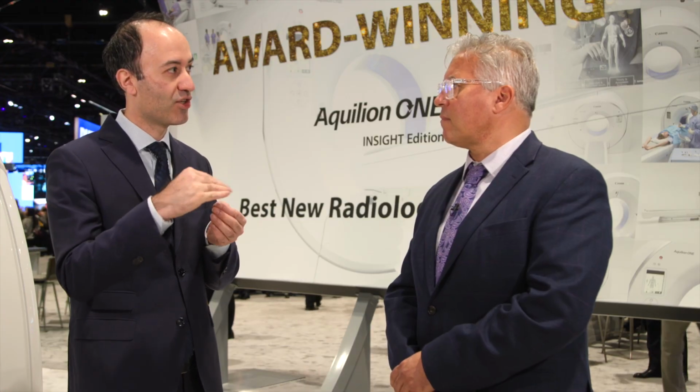So you get a super resolution as low as 0.25 millimeters, but the actual source images that you input into the algorithm are 0.5 millimeters. So you are not adding the dose, but you are actually increasing the resolution. So I think all the images will benefit. They are still working on some, for example, lung reconstruction for this method, which is going to be available soon. But for the rest of the mediastinal window and other structures that we've used, we made it the default.